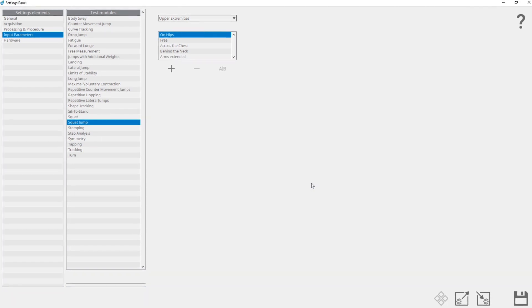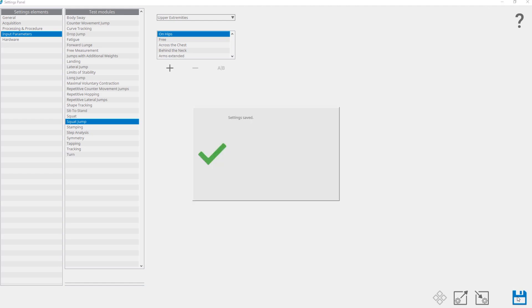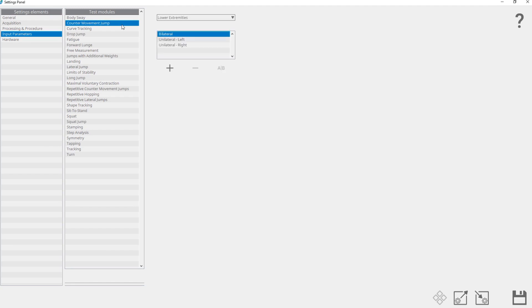You have successfully created the 'arms extended' input parameter value for the input parameter 'upper extremities' for the test module squat jump. Before you continue with the settings, you have to save this new input parameter value by clicking the save button. Note that the input parameter 'upper extremities' in other modules does not have the new value 'arms extended' because each test module has its own input parameters and input parameter values.